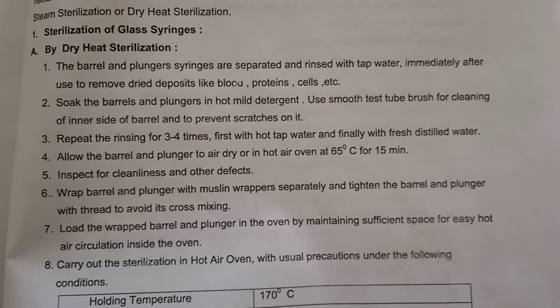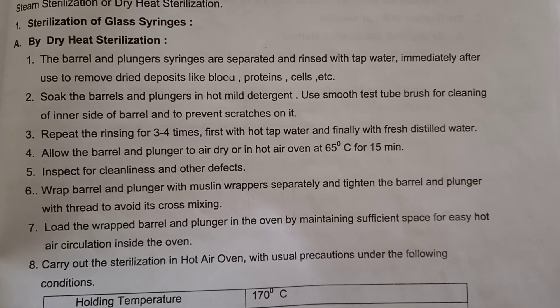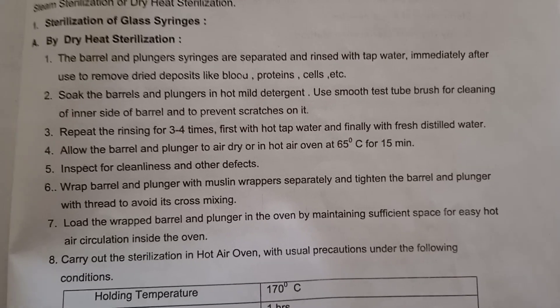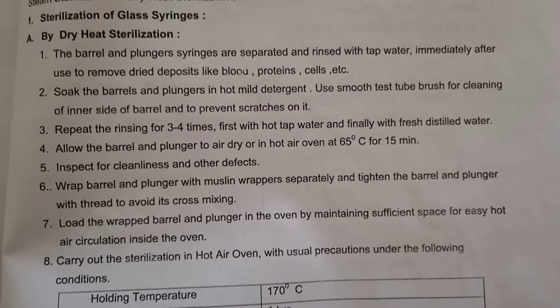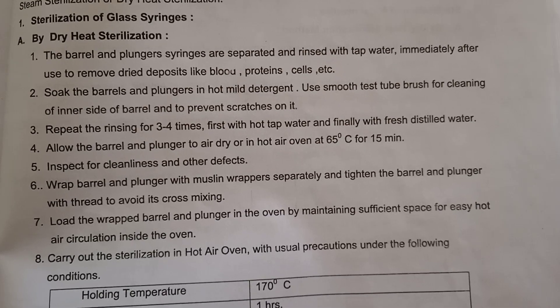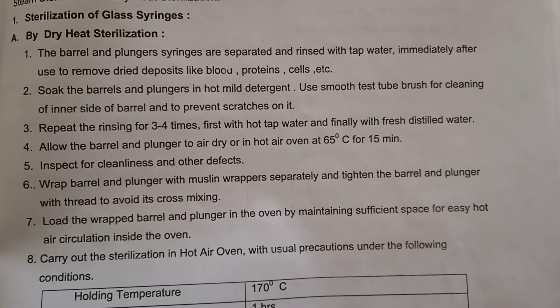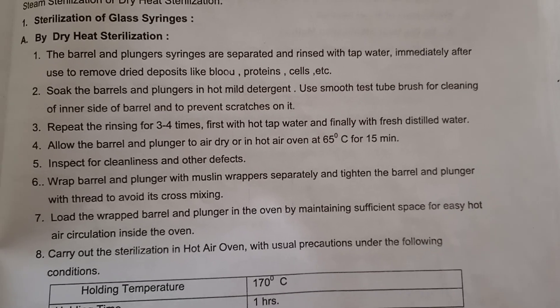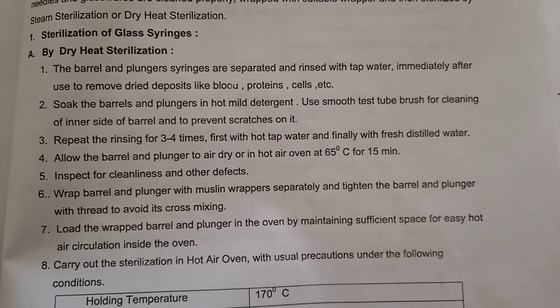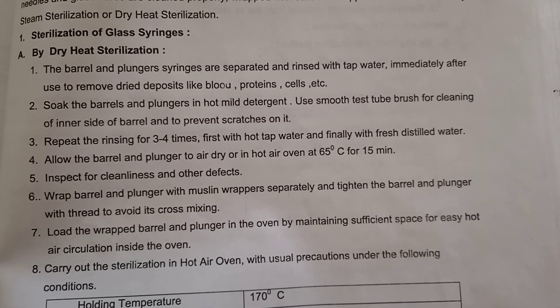For the cleaning of all these glass syringes, glasswares, and needles: first you have to separate the barrel and the plunger of the syringes and then rinse it with tap water immediately after use to remove dry deposits like blood, proteins, and cells. Then soak the barrels and plungers in hot mild detergent solution. Use a smooth test tube brush for cleaning the inner side of the barrel to prevent scratches. Repeat rinsing three to four times to remove all detergent particles, first with hot tap water and then finally with freshly distilled water.